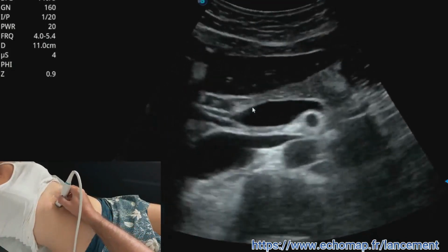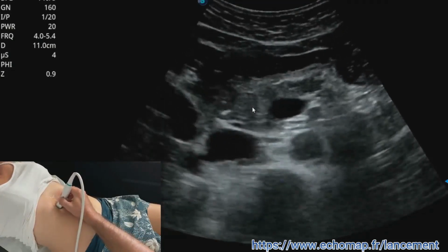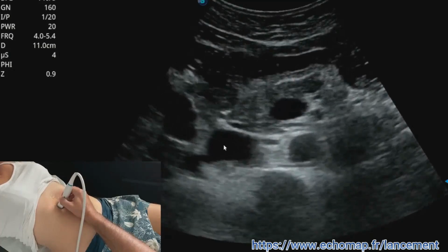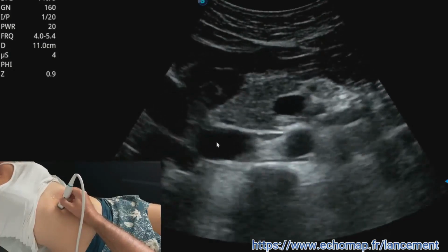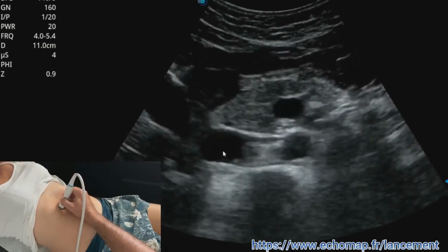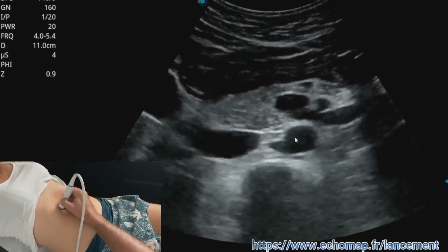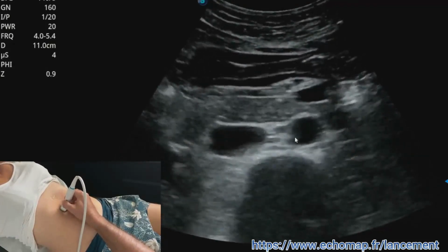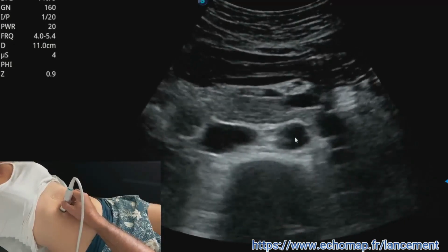So, the aorta, unlike the vena cava, is quite round and pulsating, whereas the vena cava you see on the other side is a little flatter and doesn't have quite the same pulsatility. So maybe take a little peek if you see it flutter like a gull's wing. It's not quite the same, whereas here we have a well-rounded, well-toned vessel that pulses in a very regular way. With a little help, you'll learn to spot it without too much difficulty. And if not, you'll remember that it's on the left, so that won't pose any difficulties.